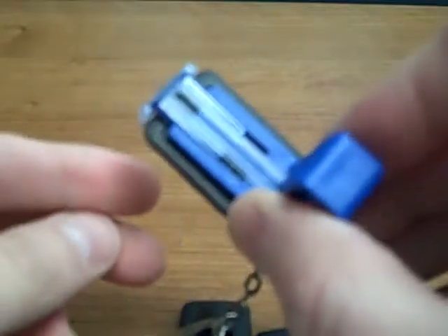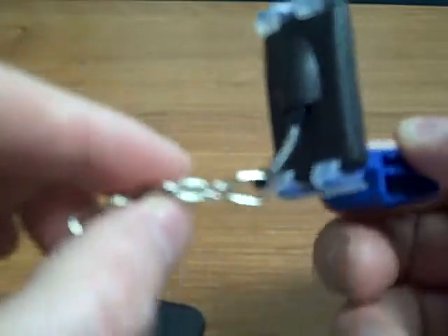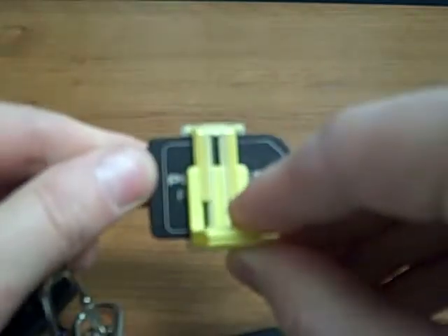Here's the PlanMECA Pro Sensor size 1 — this is just a dummy sensor, but you can see it holds it nicely. There's no tension around the cord area whatsoever. There is one bite block for each specific indication. This is the posterior holder, and you can see it holding the size 1 or size 2 in a horizontal orientation.